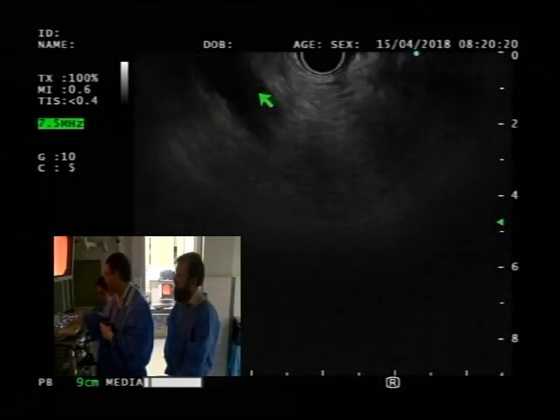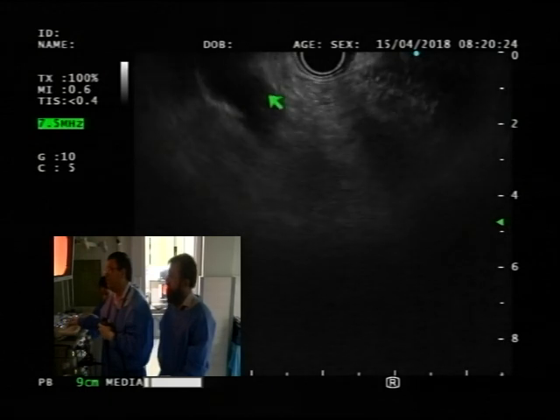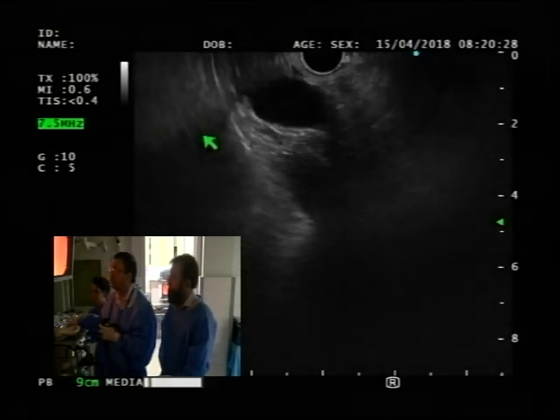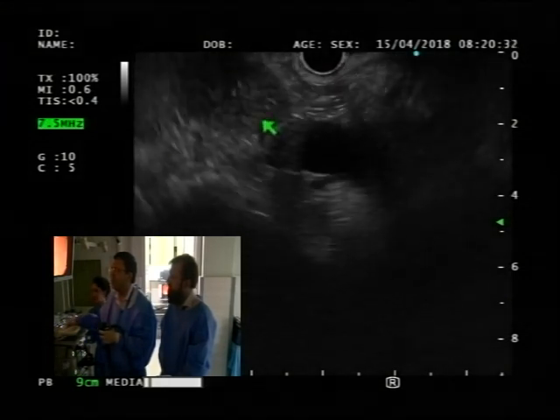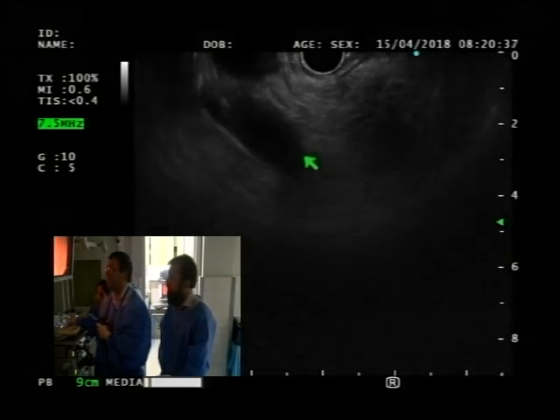Okay. So here, this is the aorta right there. I'm in D2. There's the IVC right on top of that. If I go further to the left, then I should be able to see a kidney right there. You see that? Right there is the right kidney, IVC, aorta.